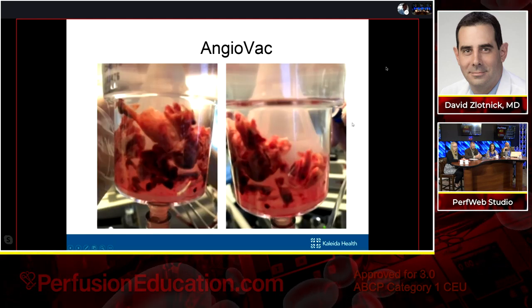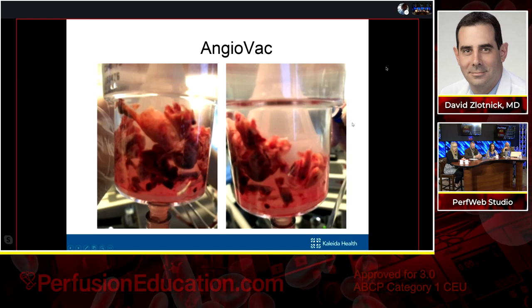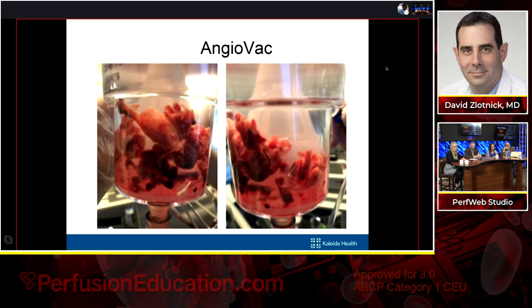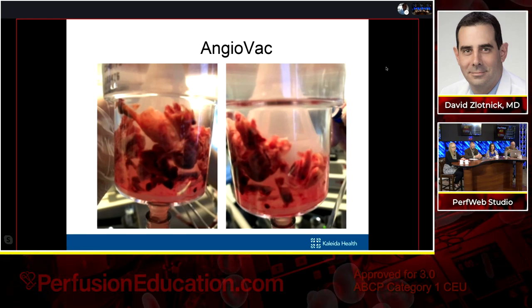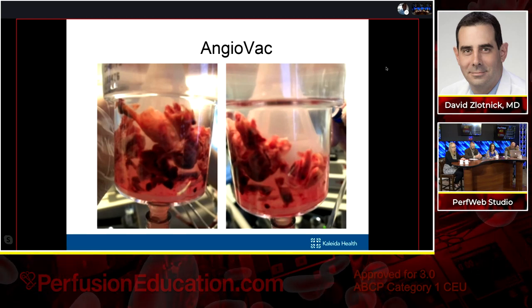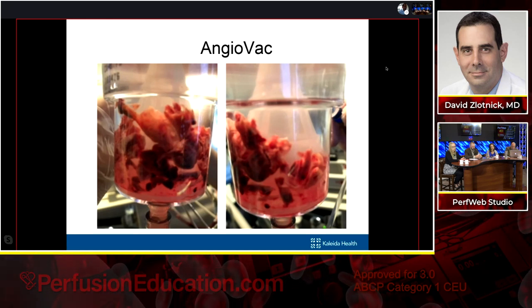So we got a lot of thrombus material. We were able to debulk. Now, again, for these cases, this is not clot that we're going to be able to readily see on a transthoracic echocardiogram. So for these patients, we have to intubate them and use TEE imaging for us to see.